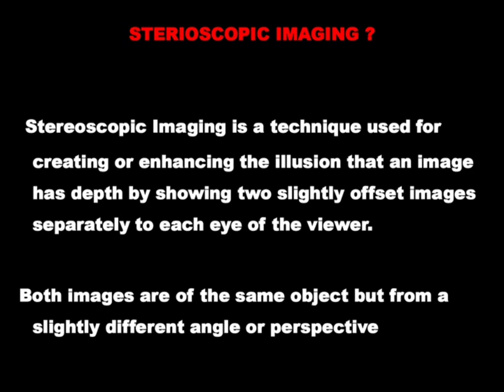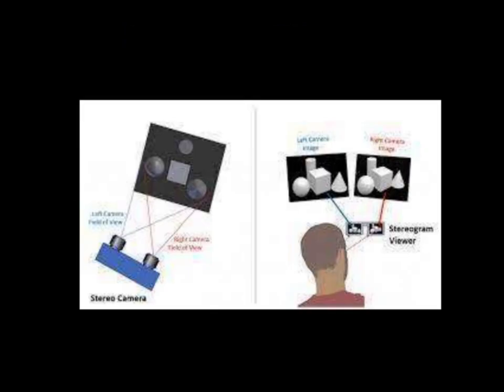You must have learned about orthogonal imaging in the case of CA cervix, where an AP view is taken and then a lateral view, so that the position can be assessed, as well as the CT compatible applicators, so that you can go for proper imaging, contouring, and execution of radiotherapy.